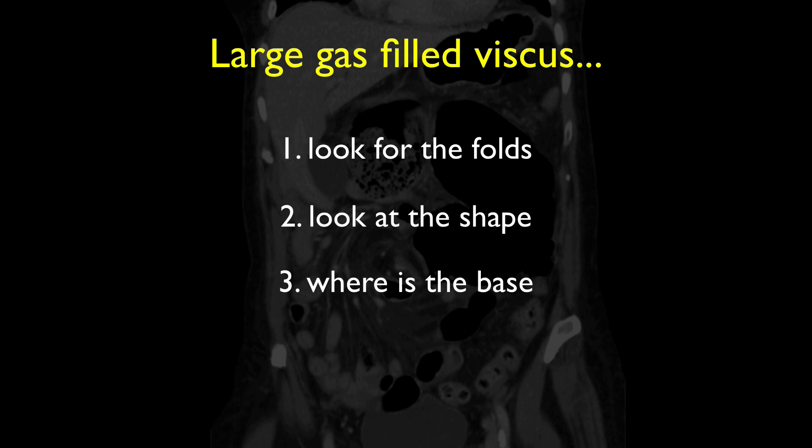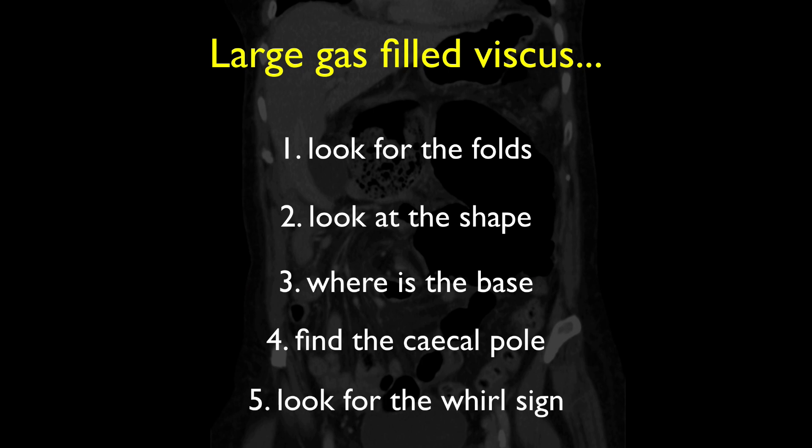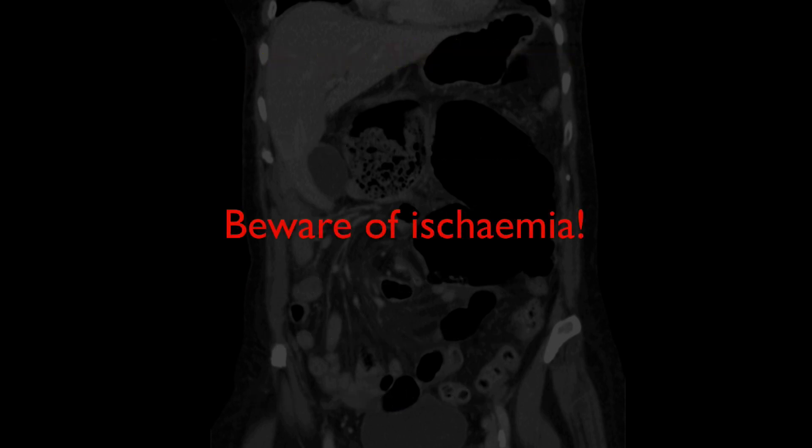On the CT, look for the cecal pole, which will not be in the right iliac fossa in a volvulus. Follow the cecum and look for a twist — known as the Whirl sign — in the bowel, the mesentery and the vessels. A complication of cecal volvulus not seen in this case is ischemia, which may lead to poor enhancement and gas in the cecal wall.